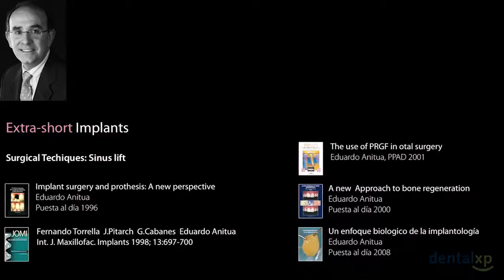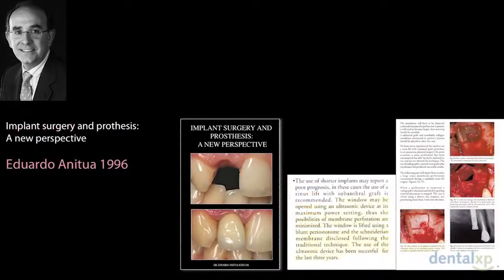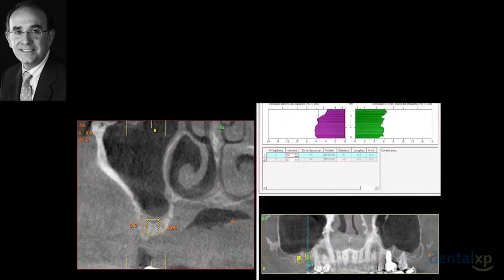I published many articles and observed in this book, 20 years ago, I published the first article in the literature to use the ultrasonic device to open the window, and this was this book, and also I published many other articles. Now, I want to show you our clinical experience.